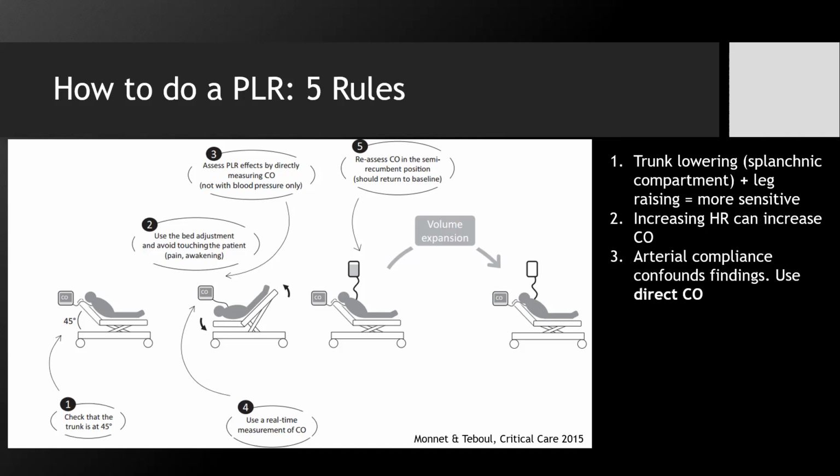You could still study passive leg raise with pulse pressure variation, and it has been done, and find how useful or how reliable or accurate that is. But most people who are advocating for using passive leg raise will tell you to only use this with the direct measures that I pointed out earlier.